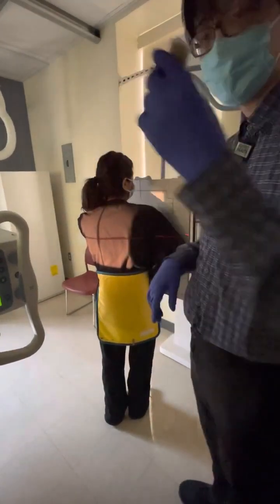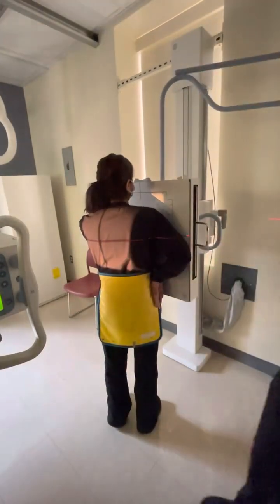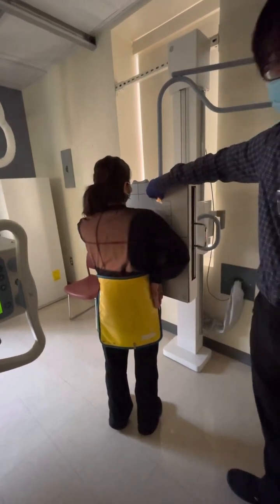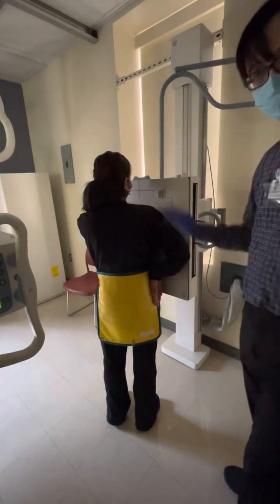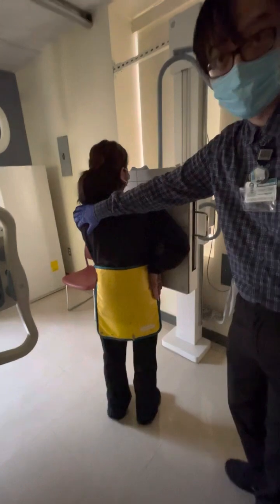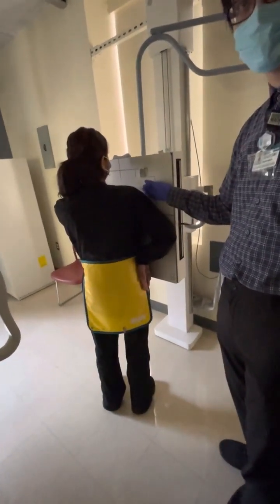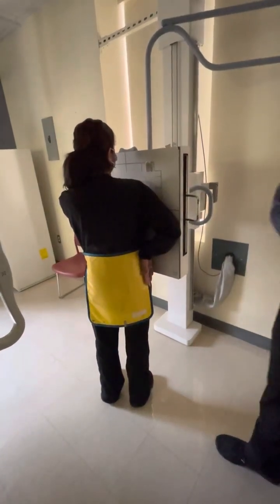So even though I am interested in the left ribs, I'm going to go ahead and mark the side which is closest to the IR, which is my right side. So yes, I know, this is not the side of interest. This is the side of interest. But I'm just marking whichever side is closest to the IR, just like all my other obliques. All right, any questions?